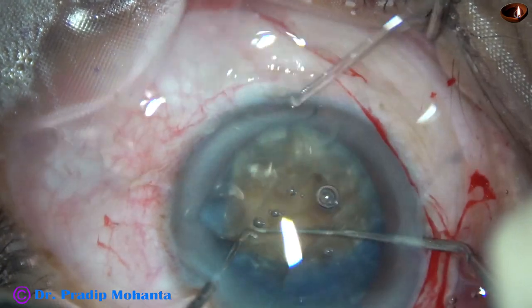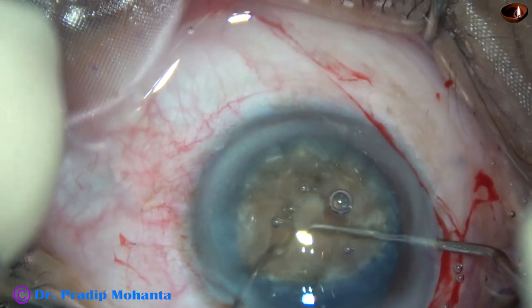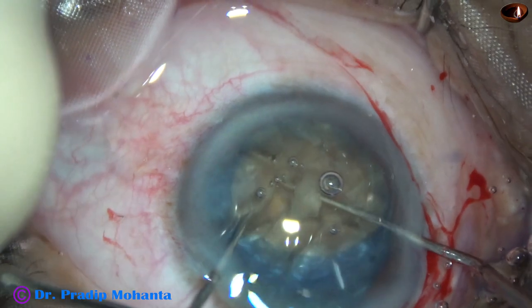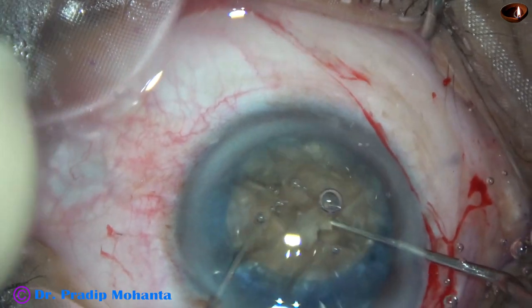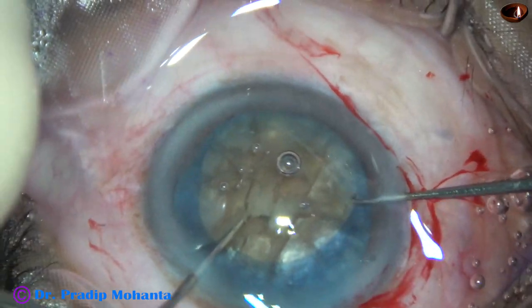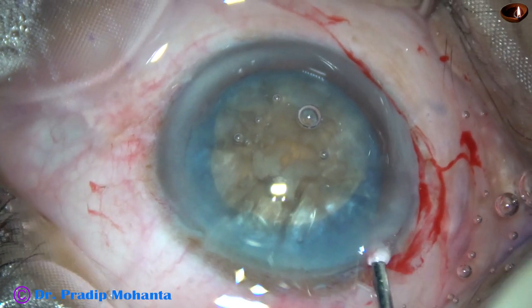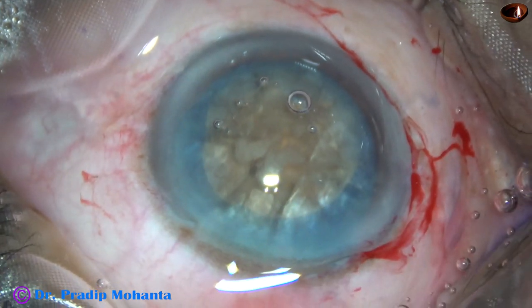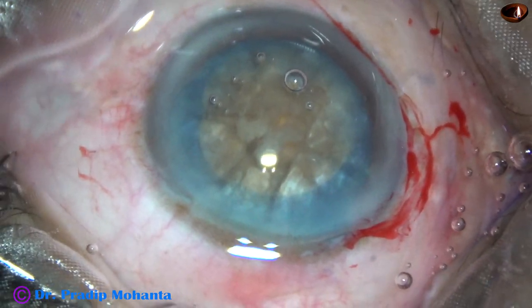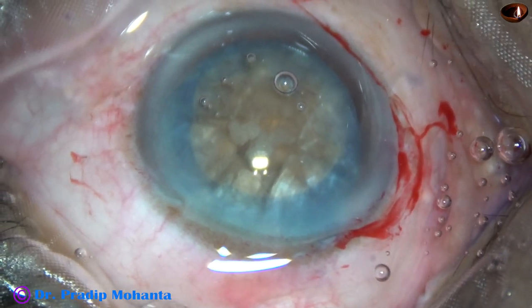I am not getting any free pieces till now. But suddenly I get two halves — yes, that is nice. So this manual work is the turning point in this case. From here, I knew that I will be able to manage this case. And now I go again.